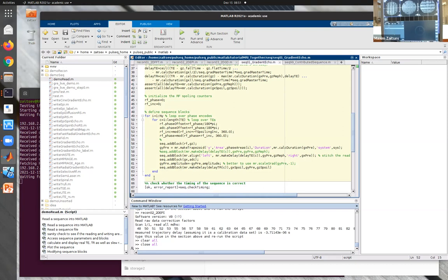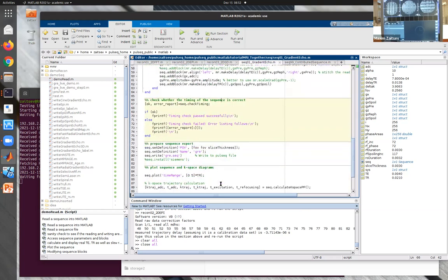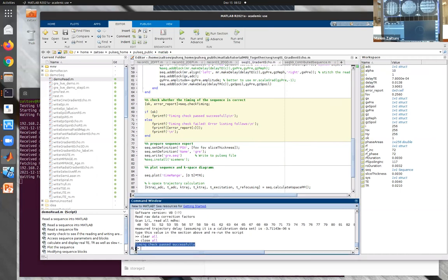Okay. And then it's a good idea to run this block for now. You can also appreciate that it's very fast. So the sequence is now fully generated, it's in memory. And you can see the objects defined here, and the entire sequence is already there. But before we do any further work, we actually check that our parameters are correct. And this is done by this check timing call and block. And you see timing check passed successfully.